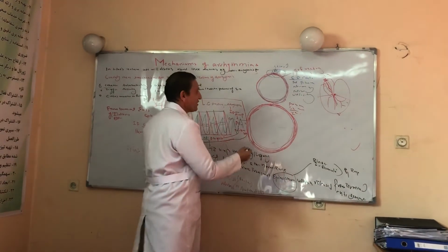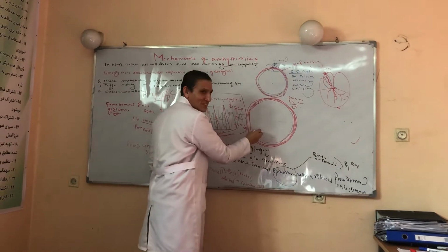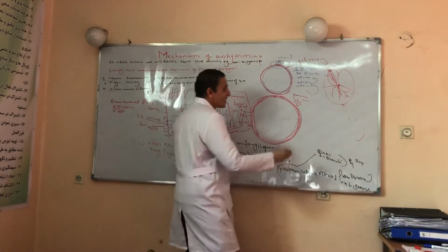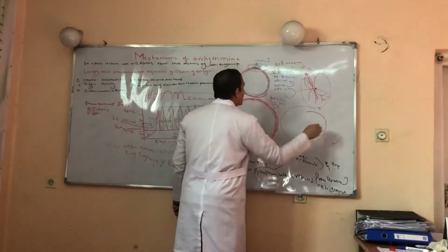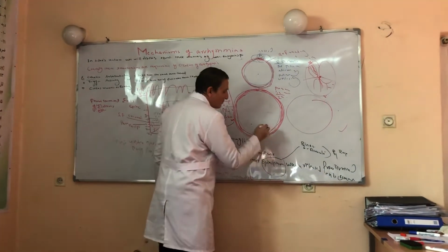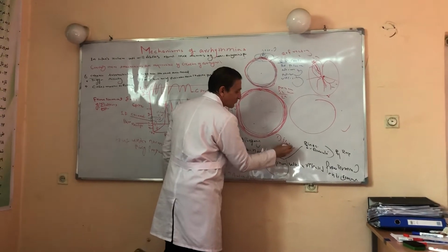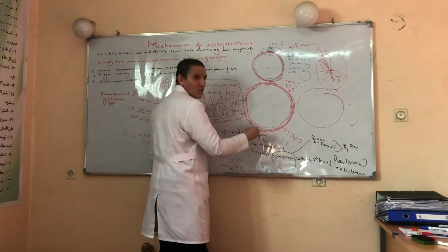In this second experiment, this time, this was a normal condition. This was abnormal. Just there, the length of the pathway is longer. Right now, in this other case, the most common cause of this longer pathway is in those people who have developed a dilated heart. In a dilated heart, this strip is also longer.